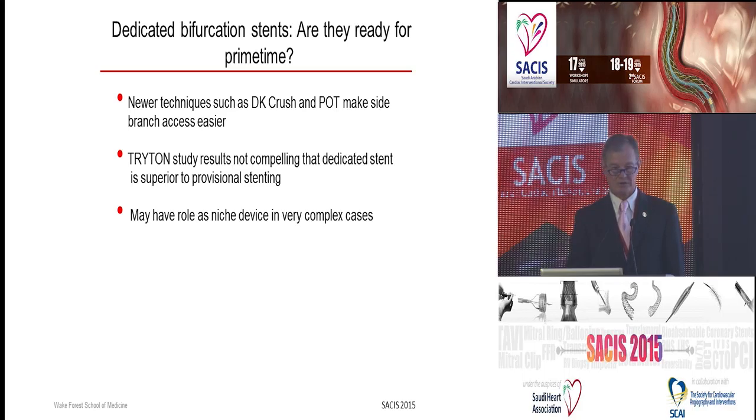What I do think, though, is that they definitely will have a role in niche therapy in certain patients where the angle, the size are so important to the patient's well-being that having access is going to be of preeminent importance, and these devices certainly can provide that.